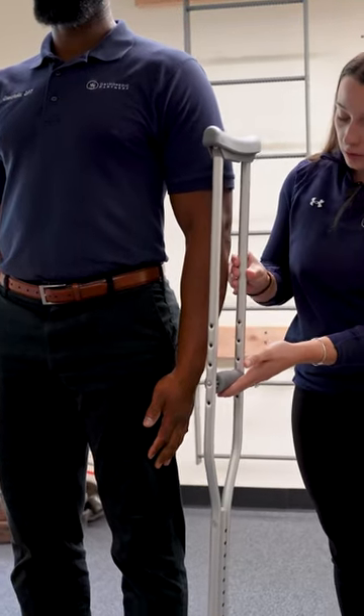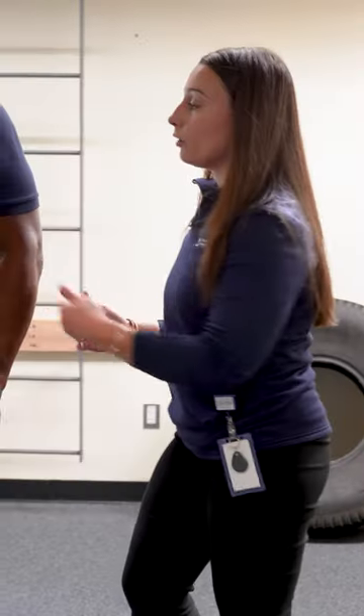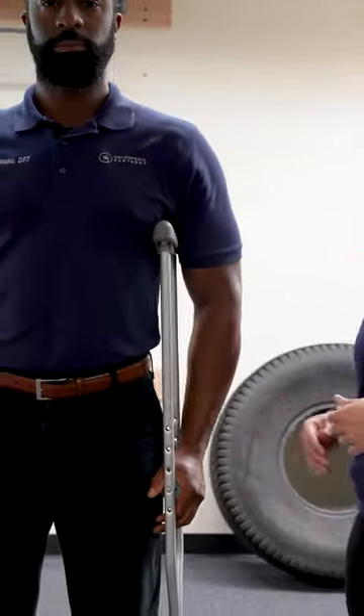You want the handle of the crutch to line up just about your wrist, so that when you are holding the crutch the elbow is slightly bent to about 30 degrees and your armpit is not resting on the head of that crutch.